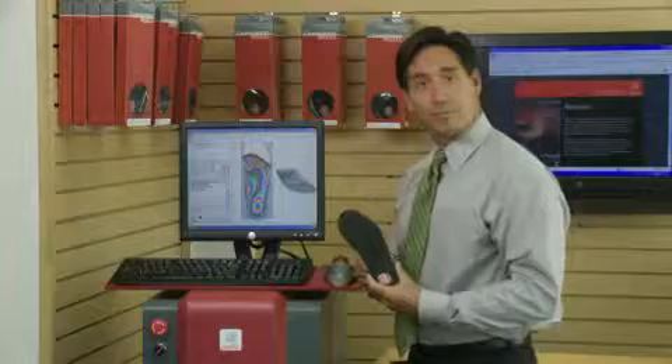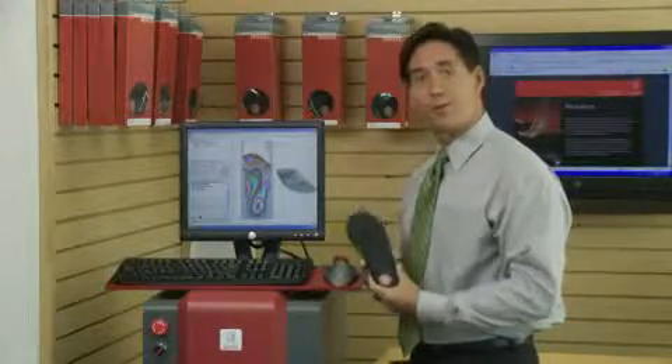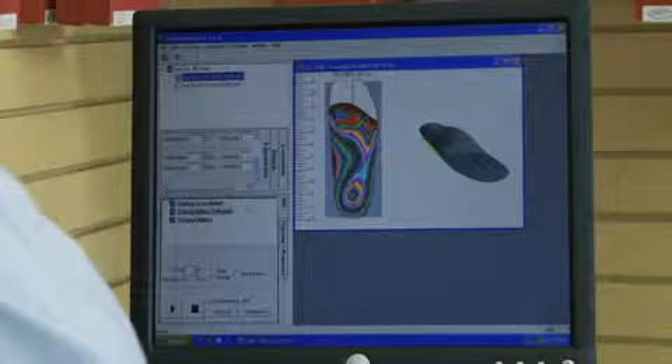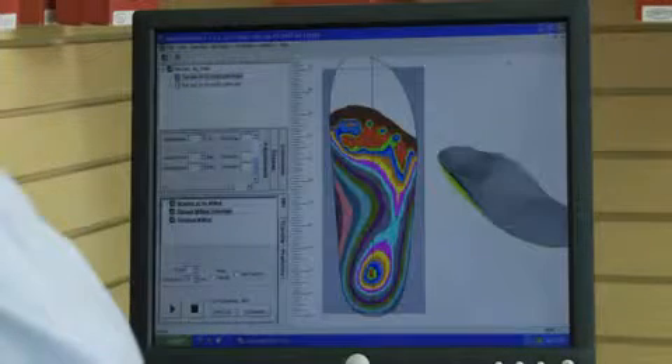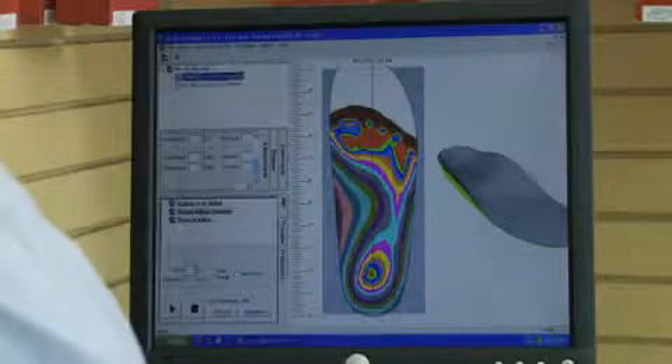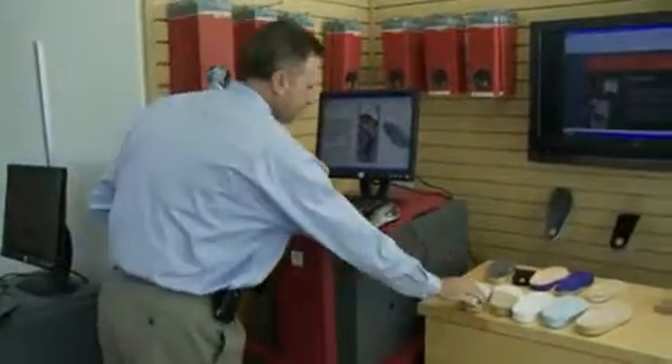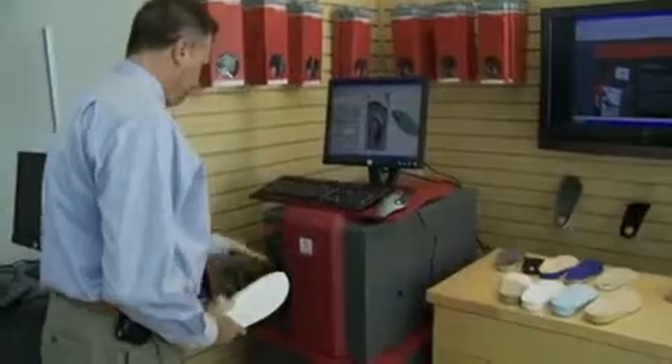With Amfit's CAD-CAM mill you can fabricate a pair of fully custom foot orthotics in less than 30 minutes. In just seconds the CAD-CAM mill receives the files transferred from your impress scanner or contact digitizer. Amfit's patented software allows you to make last-minute modifications to the file before you mill it.